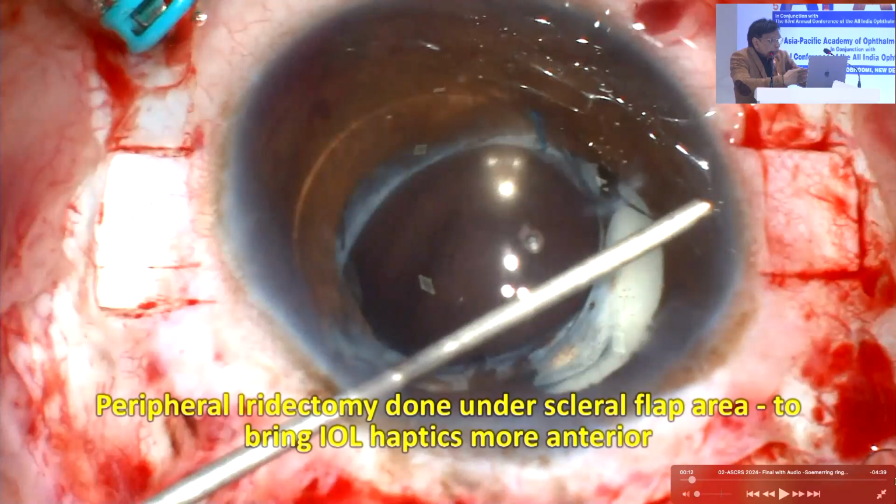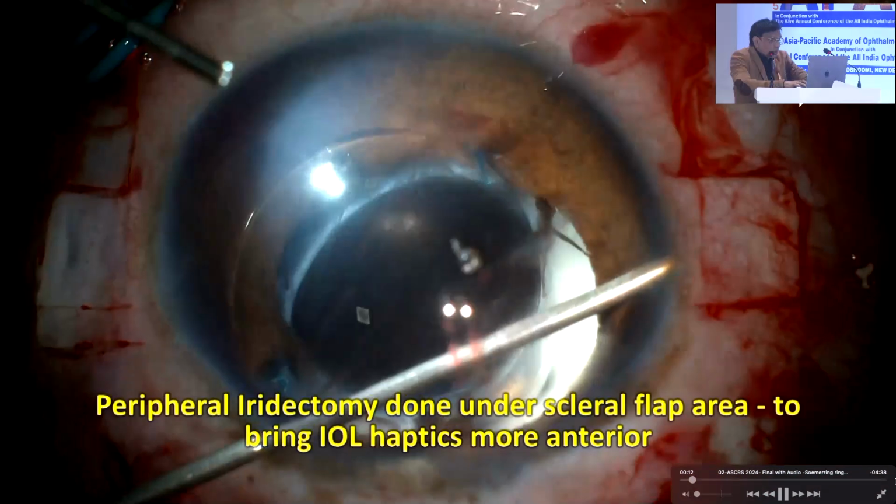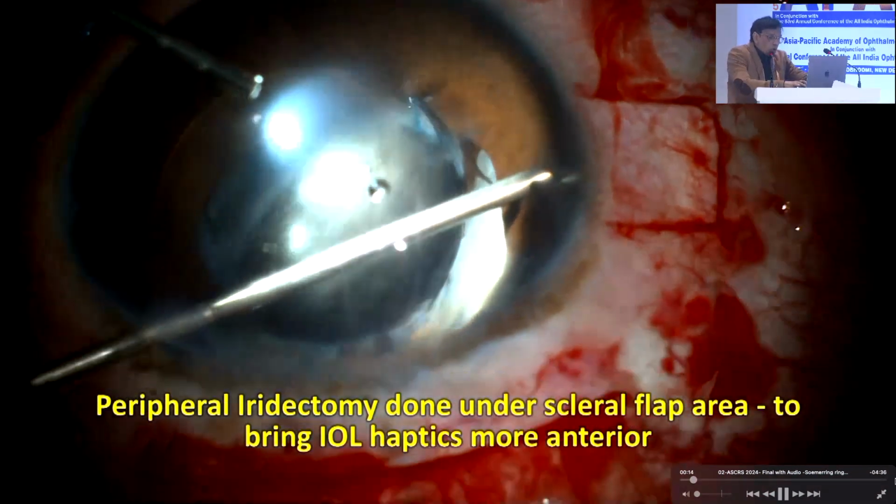Yeah, that's right. So Rohit, anything you can? Soemmering rings are the basic culprit in this, so those have to be managed. So if you manage them, then the centering would be good. So let's see what we do.